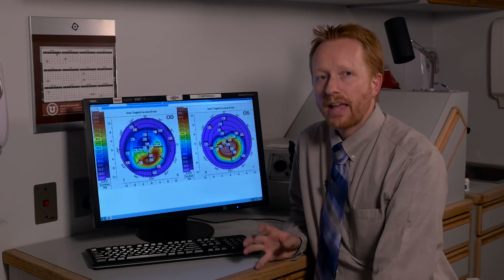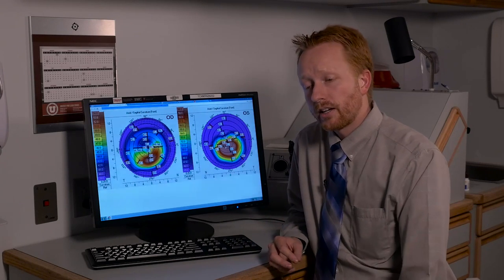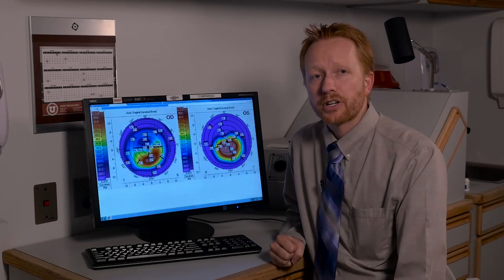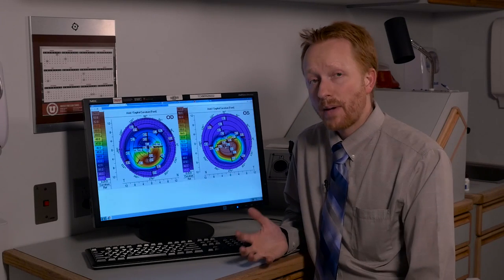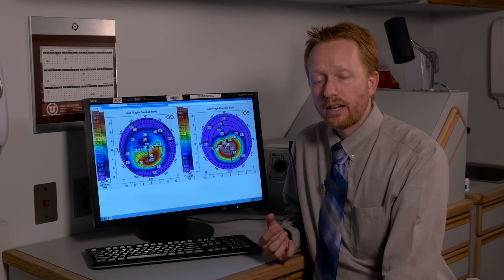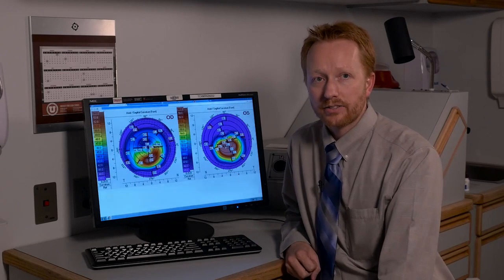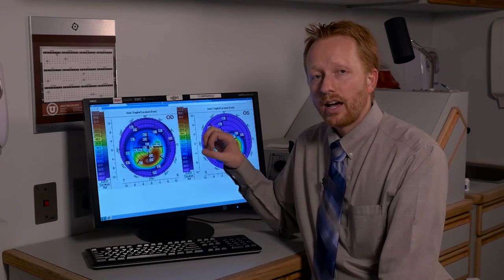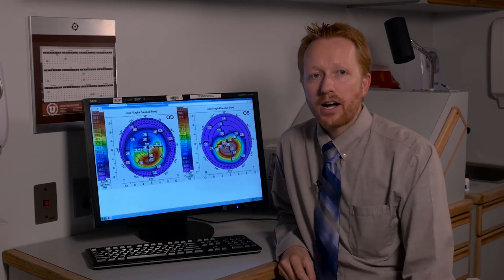Most topographers come with many other features, including pachymetry to look at the thickness of the cornea, posterior float, which is a measure of the inside surface of the cornea, and other measurements to get an even better idea of how the cornea is abnormally shaped and the best way to fit a contact lens. This is just a very standard pattern and a standard display that most topographers have.